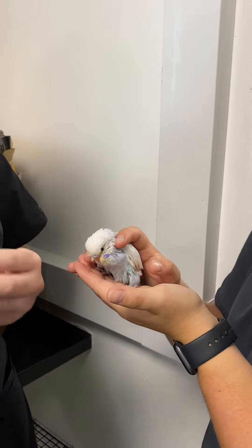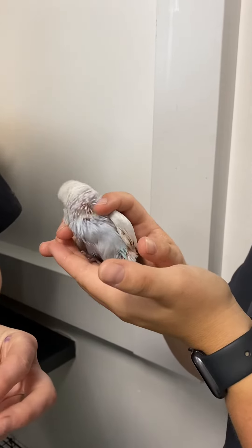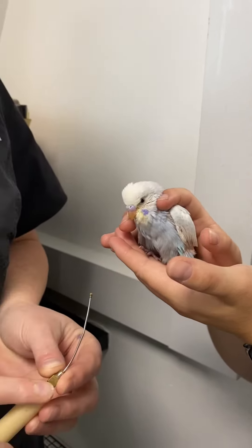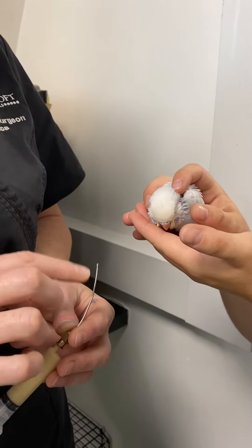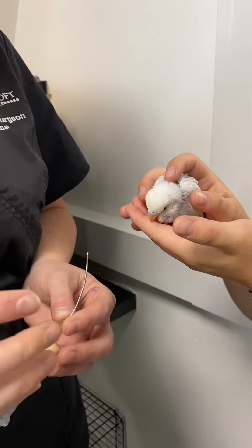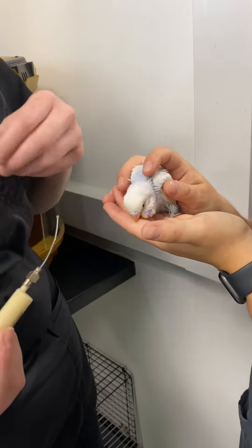Today we're going to go through how to crop feed a bird. This one's a tiny little baby, four weeks old at the moment, and this is just some syringe feed that we're going to be giving him. This is our gavage tube — it's a metal tube that we put into the crop. It's metal so they can't really bite down on it, and if they do, it's not going to damage it or them.